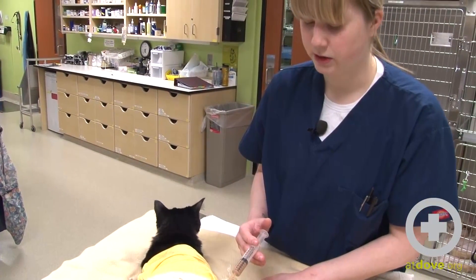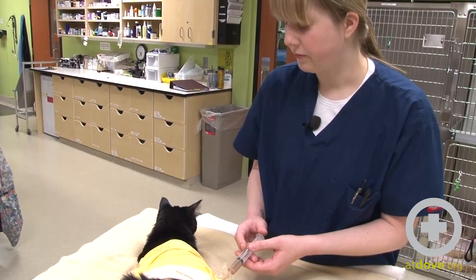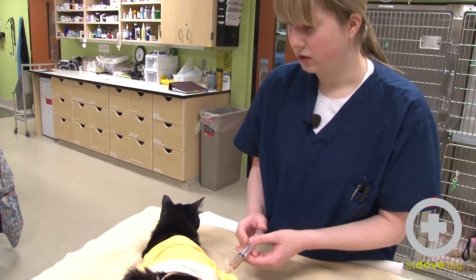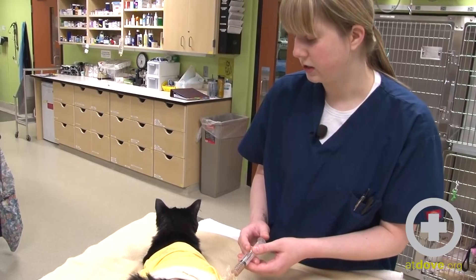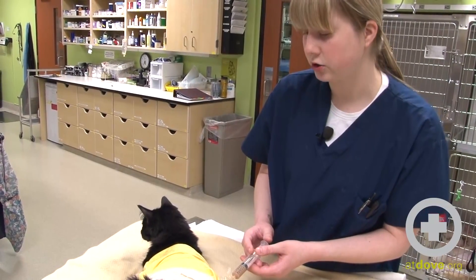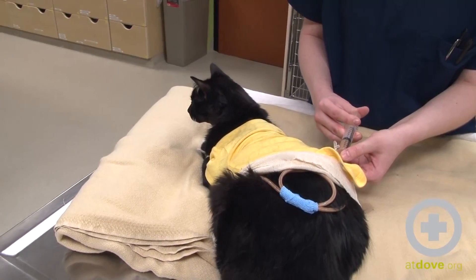During this cat's initial feedings when they first started, she was having some slight discomfort reactions. During the feeding she was doing exaggerated swallowing and gagging, so they did back off. That's why I'm going very slow with her and want to watch her very carefully for any reactions. She still seems to be doing okay, so I'll push a little bit more.